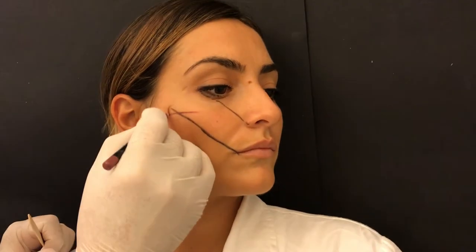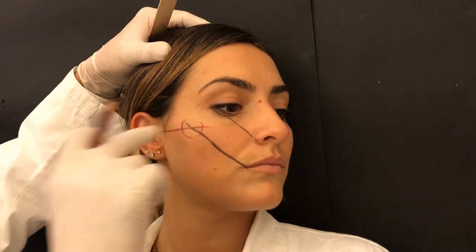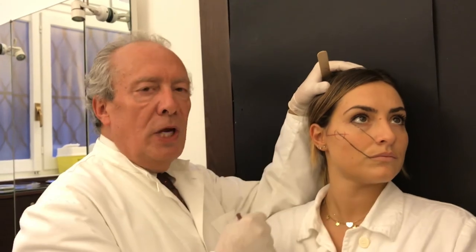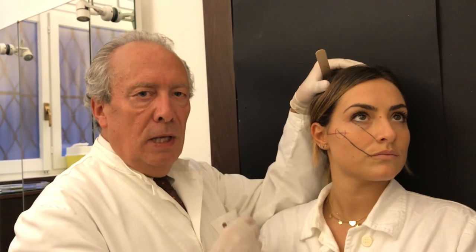Here is the malar eminence. You see that it is on the zygomatic area. I go down on the bone perpendicular with the syringe, aspiration test, well done, and inject 0.2, 0.1, 0.2 according to the patient. It will be a perfect correction.